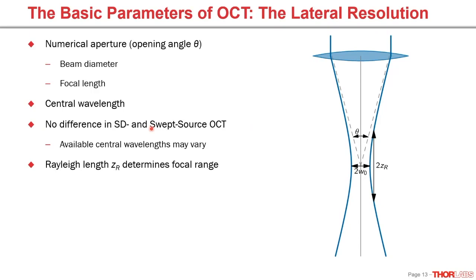In principle, there's no real difference in SD and swept source systems, except for maybe that the available central wavelengths may vary. And we need to keep an eye on the Rayleigh range because that really determines how deep we can image with the optimal resolution.